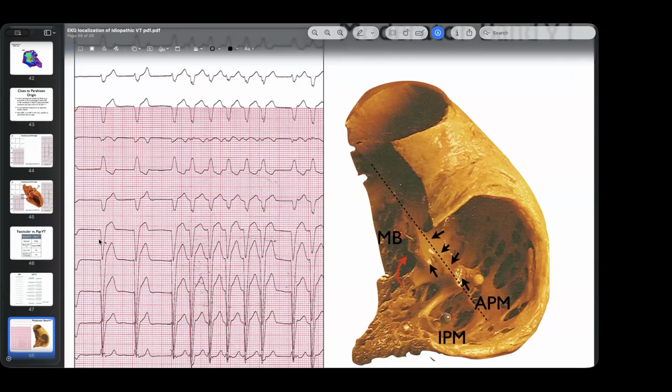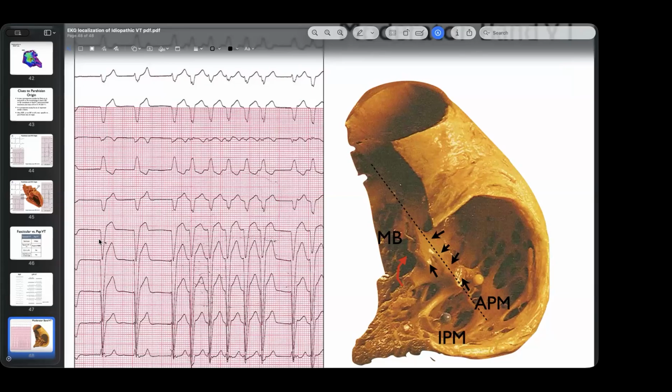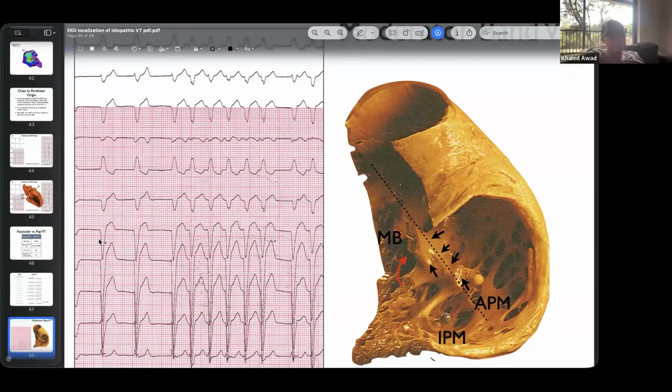This is where you start getting the stuff that needs a lot of power, because you're ablating the septum essentially. It's all coming from deep in the septum. So you might actually suppress it with ablation, but it keeps coming back, that type of thing. You need to use more power. You're probably ablating a septal VT that is exiting in the RVOT.